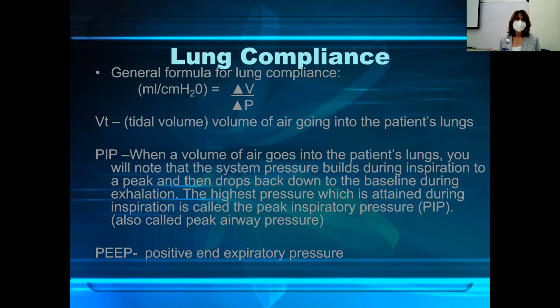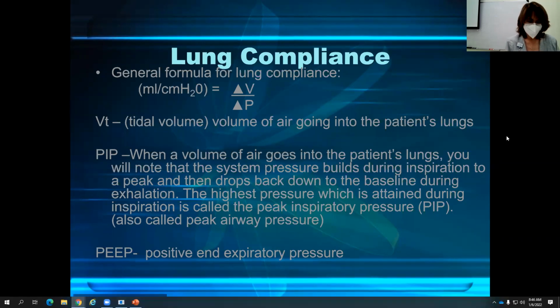So what would be the compliance if you plug these numbers in? Like the tidal volume you put into the patient's lungs was 400 ml. All right, so I just gave you some numbers.